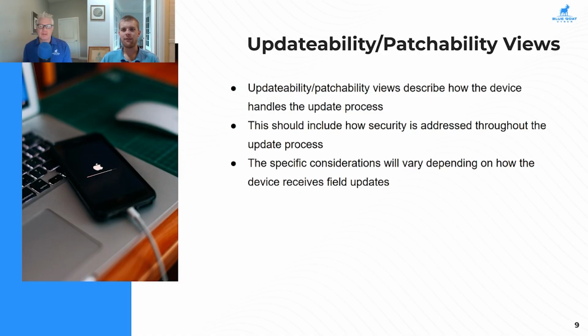And so there are a lot of different ways to go about this. Everything has varying benefits as far as the usability of the device. For example, epoxying a port shut, you probably won't get much use out of it. A physical lock can add some inconvenience to the process, but adds another layer of security. And using USB whitelisting is a fairly non-impactful approach in regards to functionality for the device.